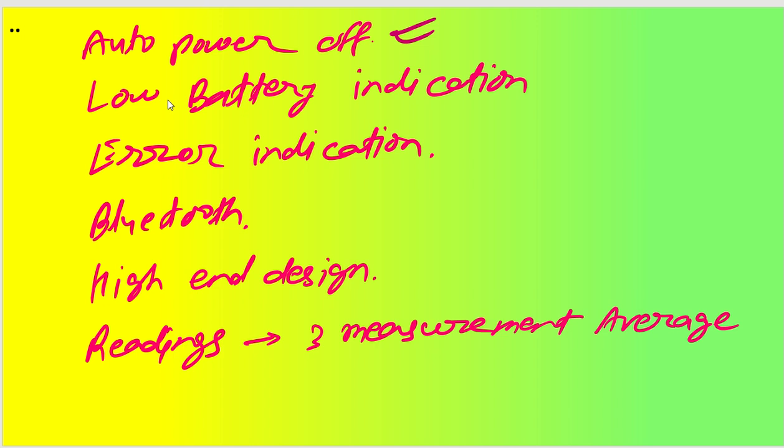If the battery level will also be kept on checking, we will give all these features in our software design, and at that time we can give a low battery indication as well, like battery voltage level is lower. That all depends on circuit design capabilities, like how you are going to design, whether you're going to have ADCs for checking the battery level or not.